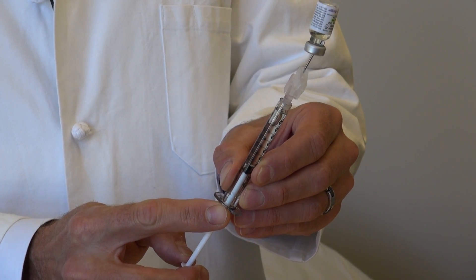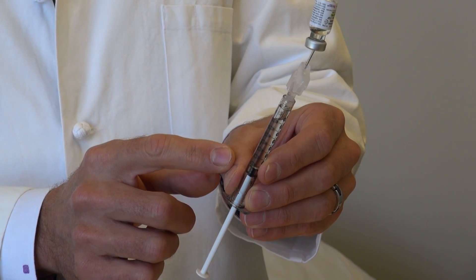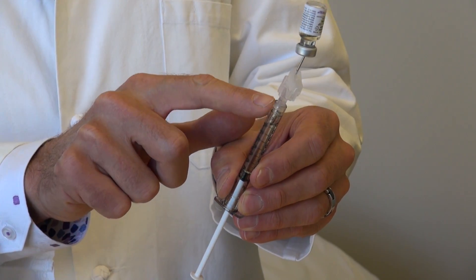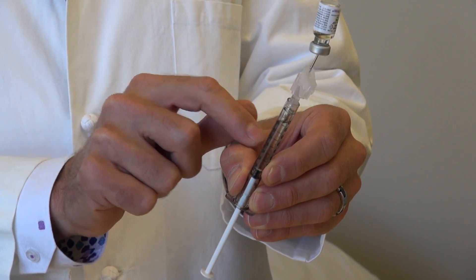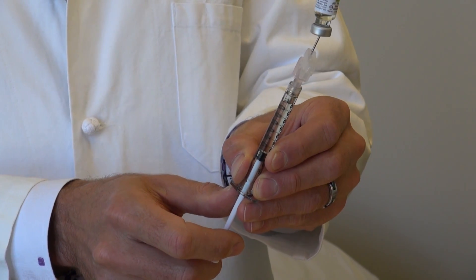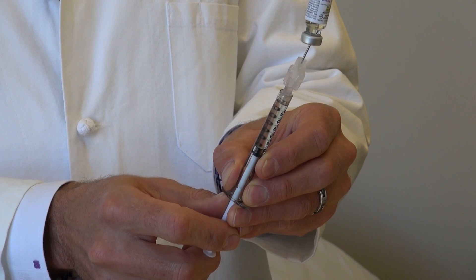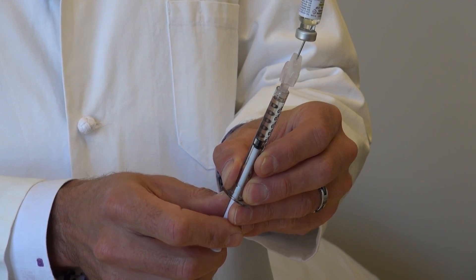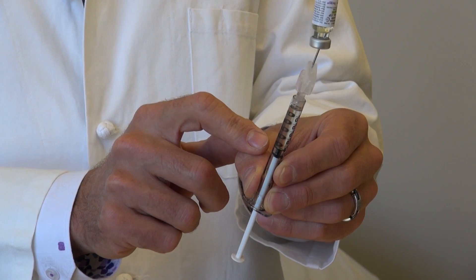Overfill the syringe — draw back to 0.8 — because there's a little air at the top. Then push back to 0.5, which pushes the air back into the bottle and leaves you with exactly 0.5 milliliters, or 100 milligrams, of actual liquid in the syringe.